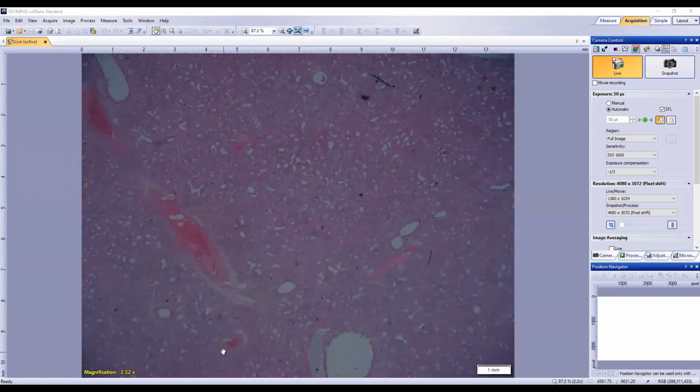Alveolar lumen, we need to look at whether there is any exudate or not, or whether there is any substance in there or not. Then we go to the alveolar lining. What it is made up of, whether it's type 1 pneumocyte or type 2 pneumocyte. Yep, brilliant. Or club cells or whatever.